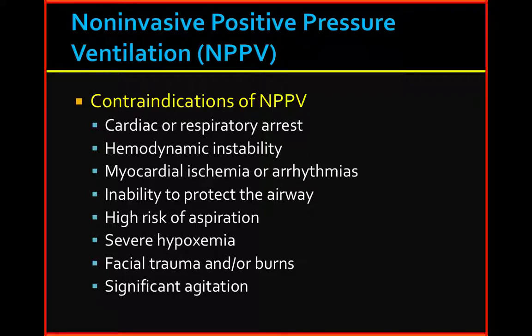The point of this is that you need to have a readout that tells you what the pressure is in that lung, so you can know what the compliance is. So in other words, in this mode of ventilation, you set the tidal volume, and the ventilator will tell you what the pressure is. You're setting how much volume of gas is going to go into the lung, and based on the compliance of the lung, it will tell you what the pressure is.